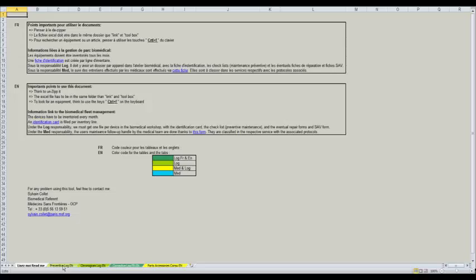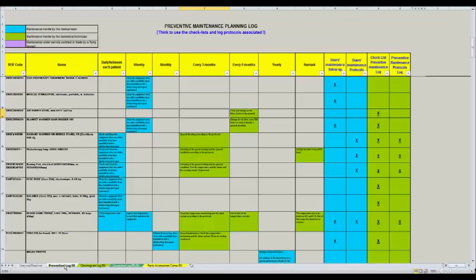First one, Preventive Log EN. This table shows the maintenance, including cleaning and preventive, which needs to be done periodically for each medical equipment present in the ITC catalog of MSF. On the top left side, there is an information box which explains the meaning of the colors.